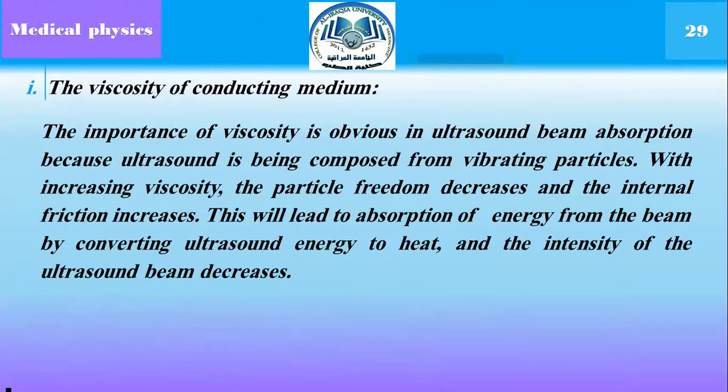For the viscosity of the conducting medium, the importance of viscosity is obvious in ultrasound beam absorption because ultrasound is composed of vibrating particles. With increasing viscosity, the particle freedom decreases and the internal friction increases. This leads to absorption of energy from the beam by converting ultrasound energy to heat, and the intensity of the ultrasound beam decreases.